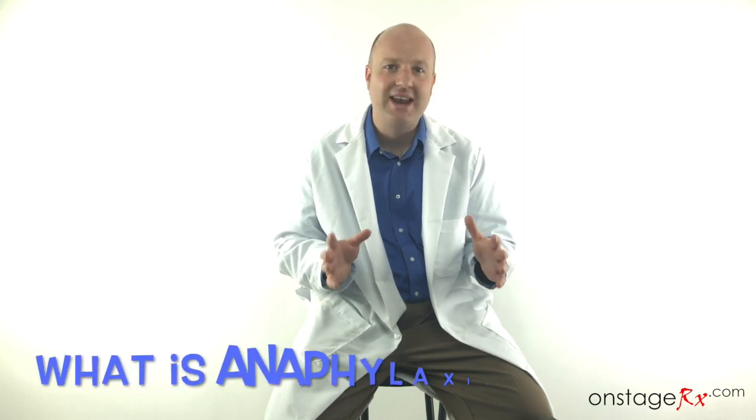Today we're going to talk to you about epinephrine autoinjectors. Because these devices are used in life-threatening situations, it's important that you and those around you receive the appropriate training. Epinephrine autoinjectors should be used by anyone who has ever experienced anaphylaxis.